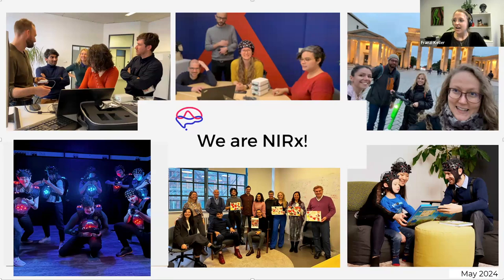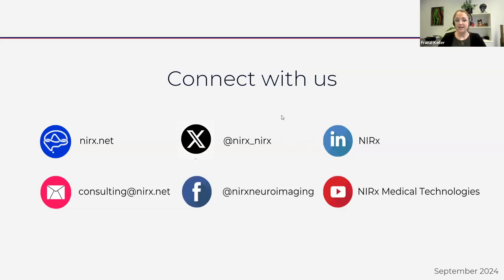And it is our goal to make publishing as easy as possible for you, and very fittingly, today's webinar falls right along those lines because we do believe that the NIRx integration with E Prime will make your experiments even more smooth.